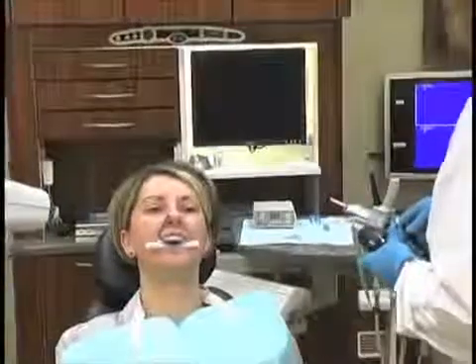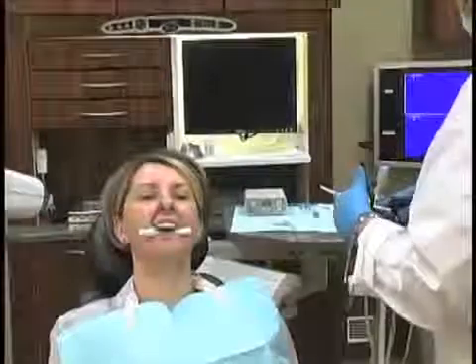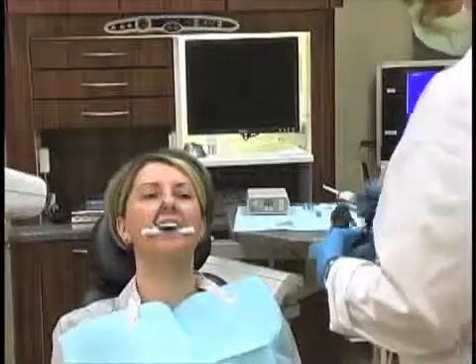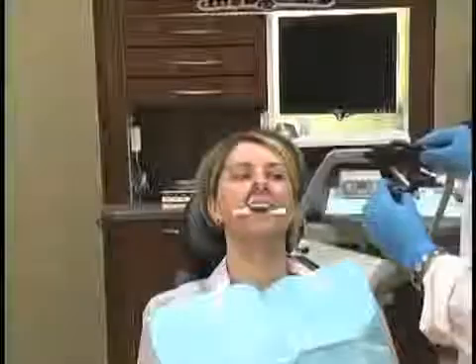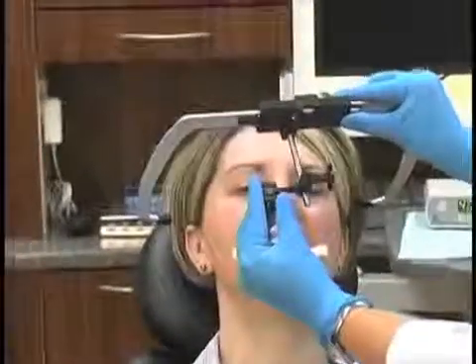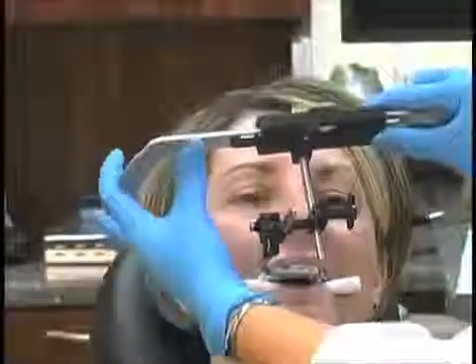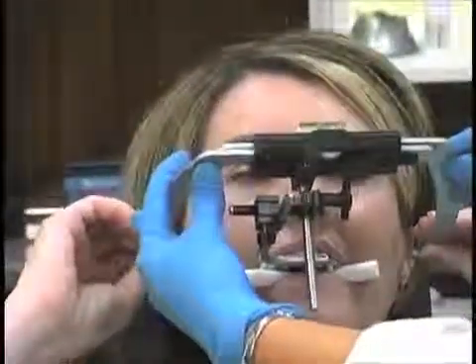Now the ear bow has two components to it. It's the part that's going to go in the patient's ear, and then there is the transfer jig. And the transfer jig is the removable part that you will become familiar with when we start talking about mounting casts. So what we're going to do now is attach the Facebow to the head, and notice the transfer jig has something that slides on to the bite fork. And we're going to have the patient help us here by guiding the Facebow into their ears.